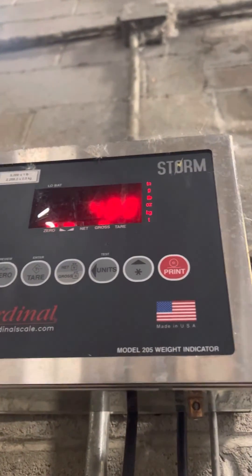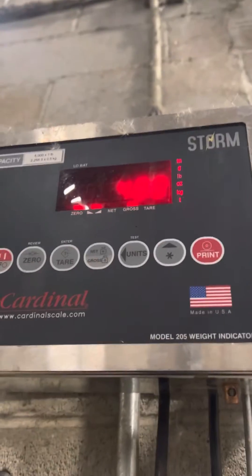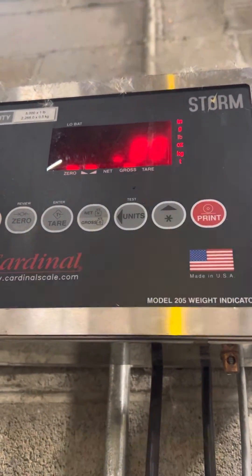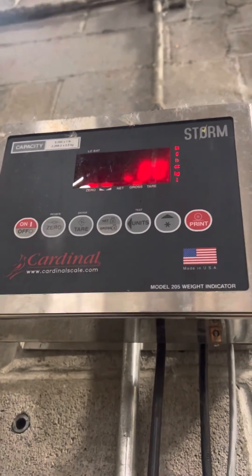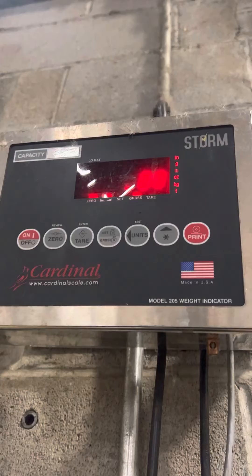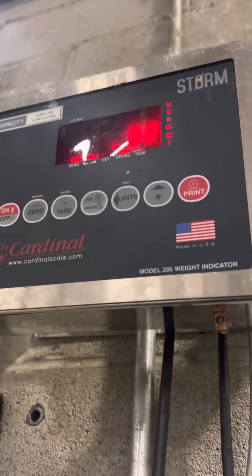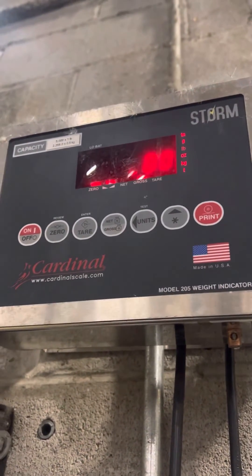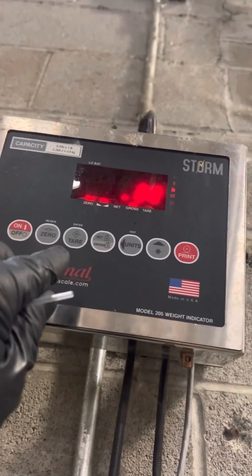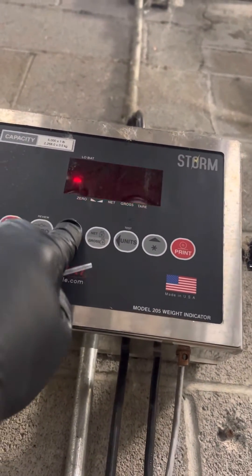At this point, I'm going to apply the weight. After your weight is applied, you're going to press ENSER.